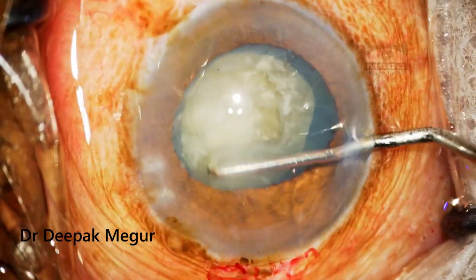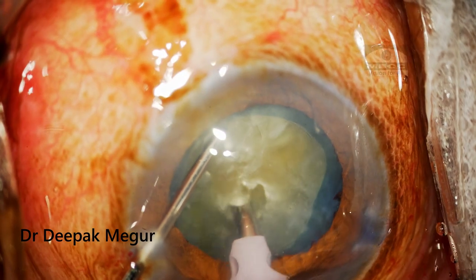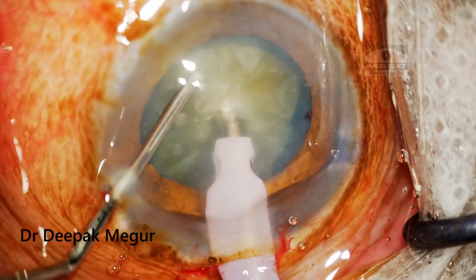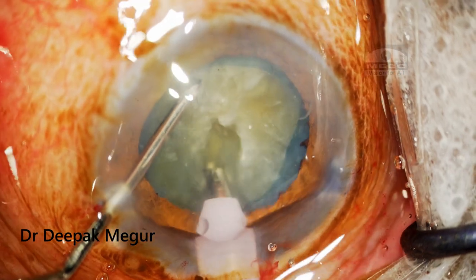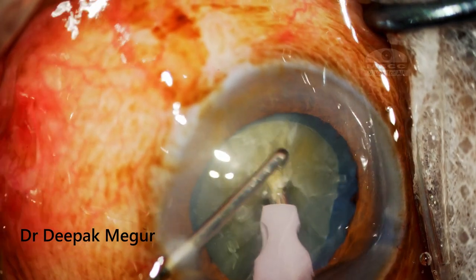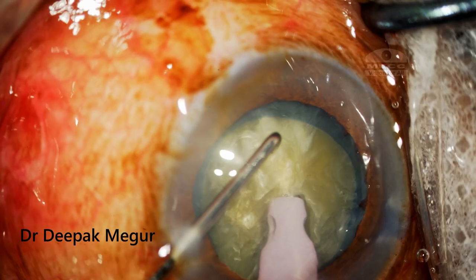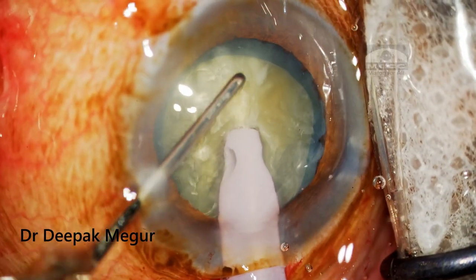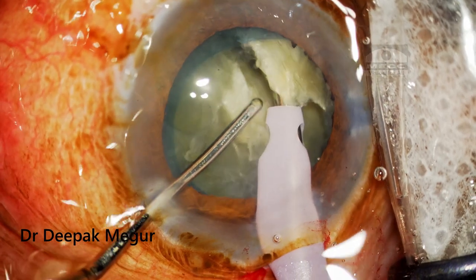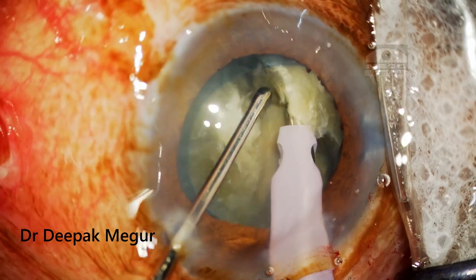I plan to do a direct vertical chop for this case. My strategy for most hard nuclei is always to create a small trench initially — I am just doing sculpting in the central part of the nucleus. The idea is to get a firm grip when doing the chopping maneuver. Then I bury my phaco tip until the entire tip is invisible and only the sleeve is seen, and then go in with my sharp vertical chopper to do the vertical chop followed by lateral separation.